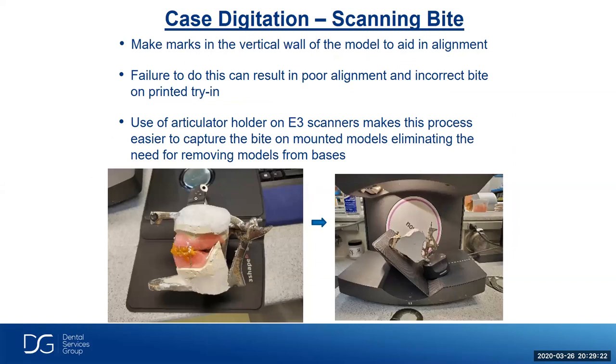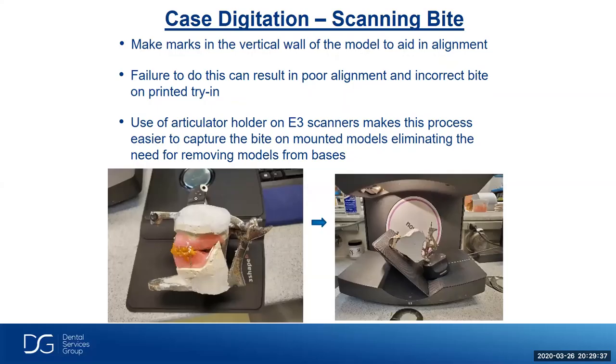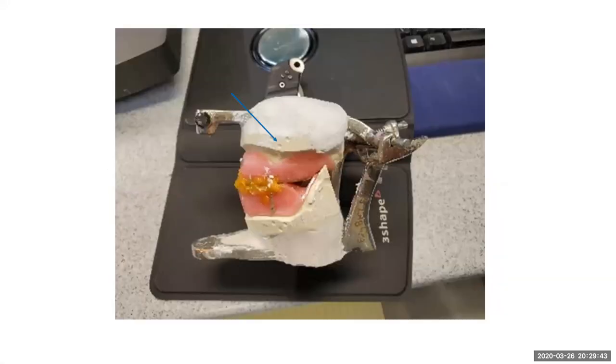In this particular photo here, this technician set this up on a hinge articulator, but as you can see, we had to put some little holes in the model here just to align it correctly in the 3Shape scanner, because failure to do this can result in poor alignment and incorrect bite registration on the printed try-in. But I don't utilize this method.